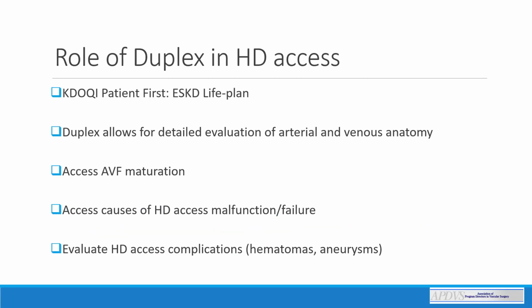Duplex ultrasound can be extremely useful in the evaluation of many problems facing patients on hemodialysis. It is a non-invasive technique that can show more vascular detail than physical examination. Over the last few decades, several initiatives and recommendations to guide vascular access decisions have been published. Most recently, the National Kidney Foundation has proposed the Patient First End-Stage Kidney Disease Life Plan.